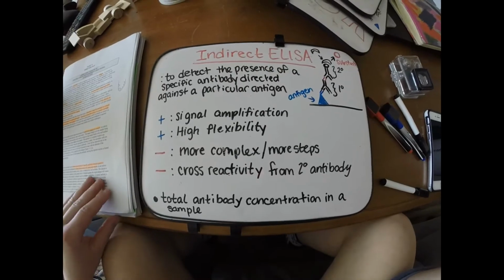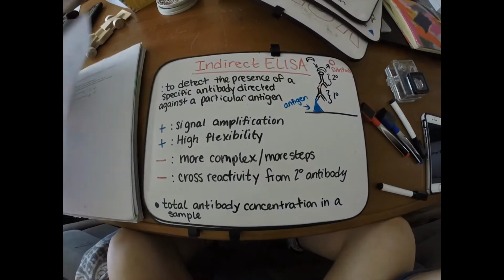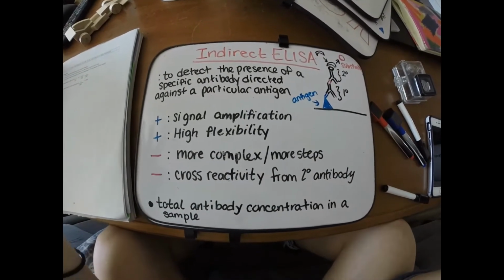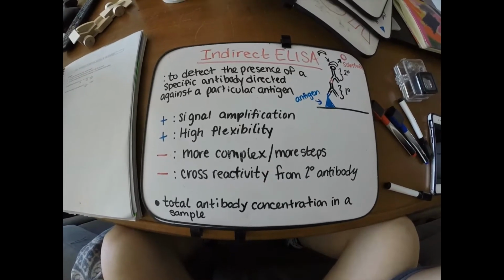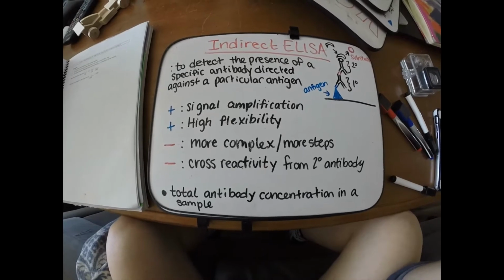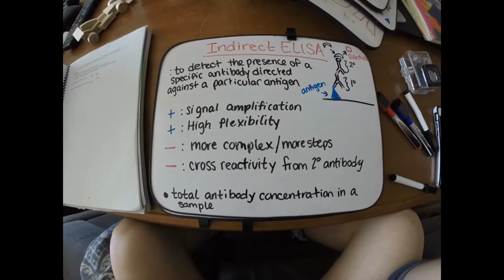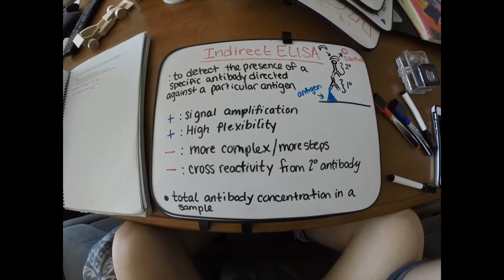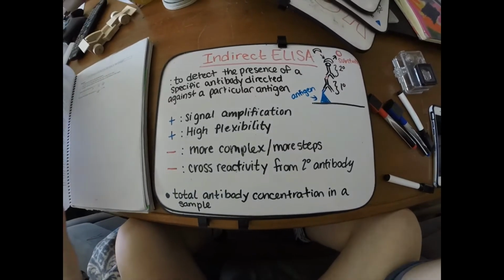In your lab that we're doing, what we're looking to do, and a lot of the different components of each step, so when you actually look at your procedure, you'll need to know why we use blocking buffers and why we use the different things that we do. That's part of the post-lab questions. And the answers for that can be found on the bottom of page 33. So take some time and read that. It'll really help you in answering those questions.